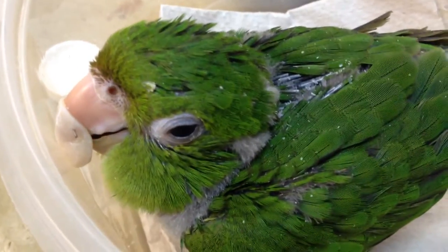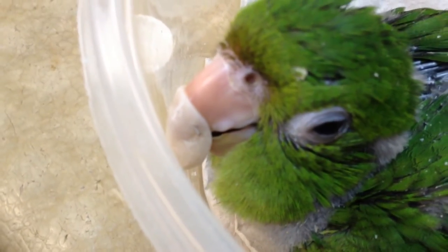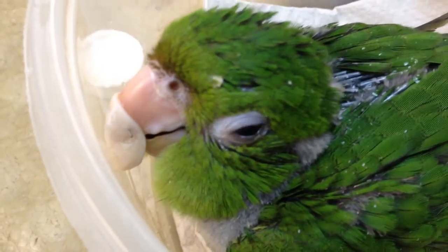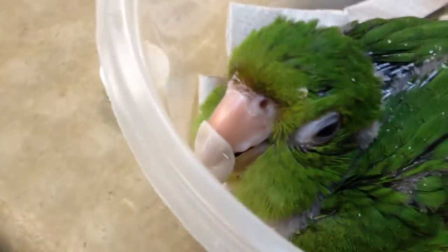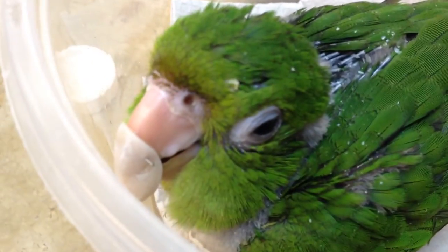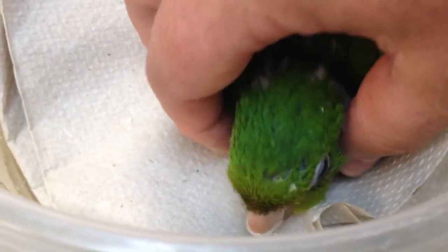This little cutie is waking up from anesthesia - very mild, but we had to do that. If you'll notice that little pin right there in the center, we had to put him down just long enough to get that piece in there to hold things in place. Anyway, what happened is this bird's got what they call prognathia, where his lower beak is much longer than his upper beak. So we had to build something to train his mouth to go back in. The little tape trick just didn't work, and this is pretty much where we're at for now.